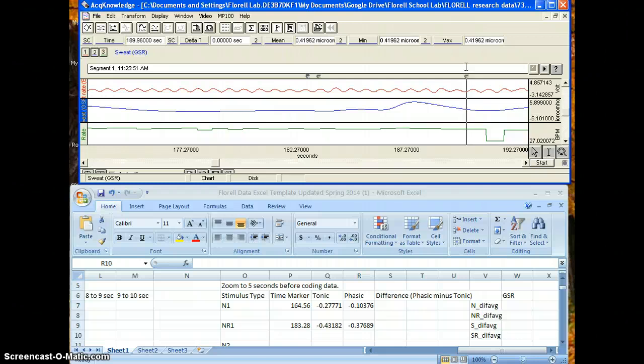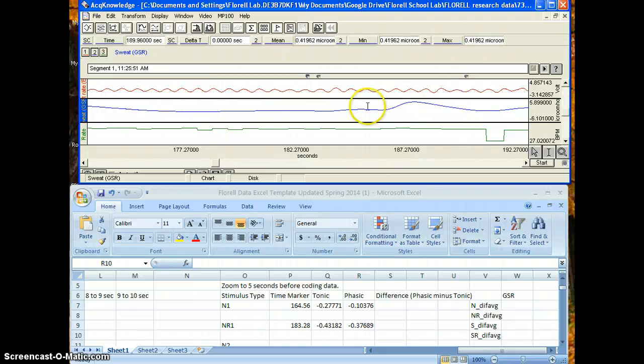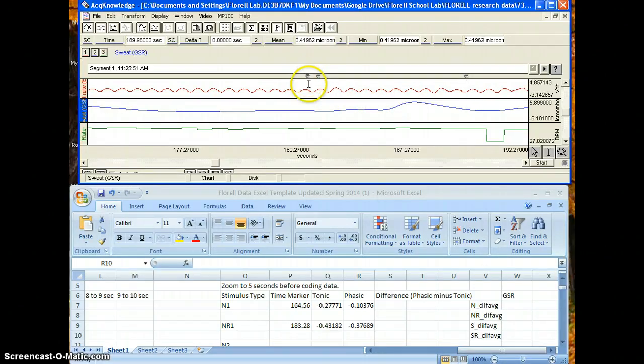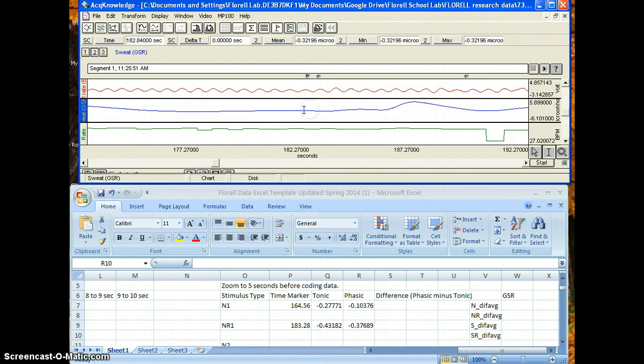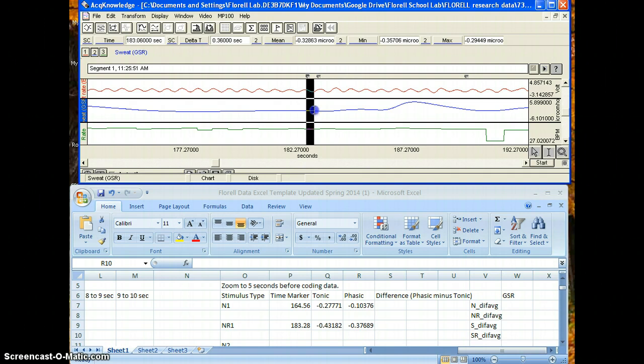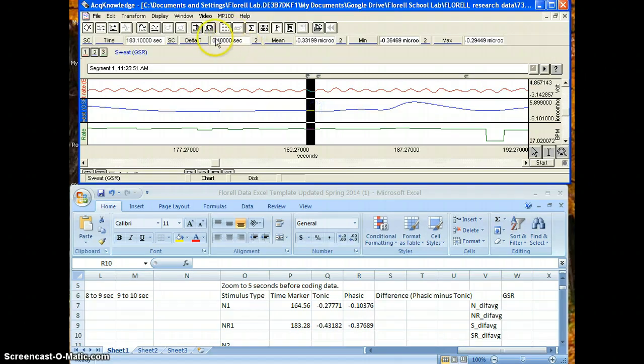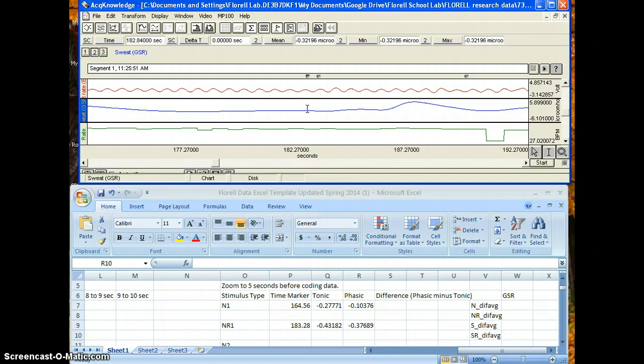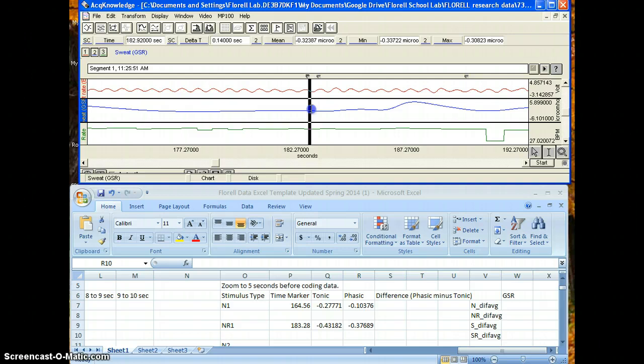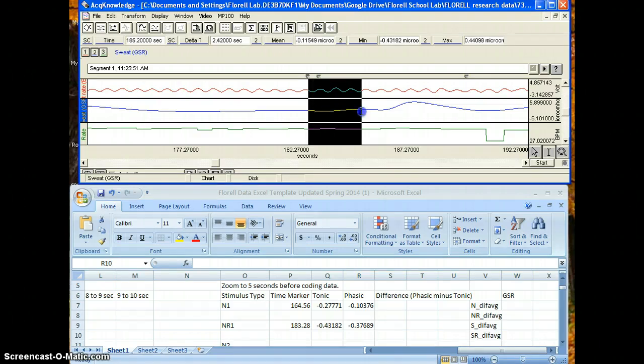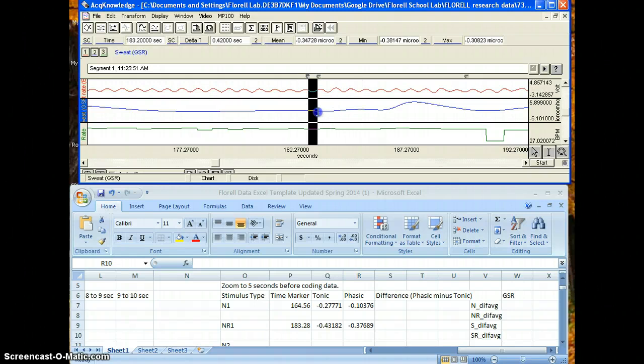If the data increases before four seconds, then you do not need to highlight all the way to four seconds. And that's the two examples that I just previously showed you. Now if for some reason, okay, so this time marker is invalid, but let's pretend it's not. If for some reason your four seconds, which you see right here on delta T, that's what you've highlighted. I've only highlighted 0.4 seconds now, but that's how you tell how many seconds you've highlighted. If your second time marker is in the way of your four seconds highlighting, which as you can tell this one is, then you just highlight up to that time marker.